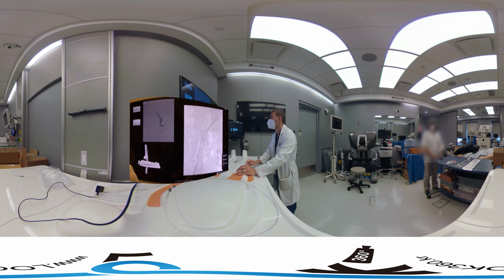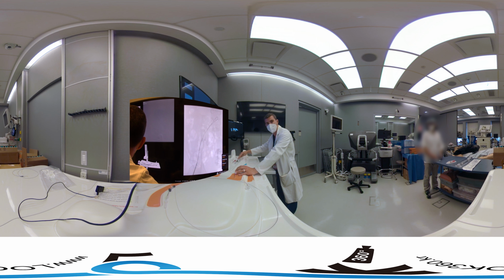That wire is probably selected in the uterine, but what we'll do is we'll come out and we'll do an injection. We'll come out with the wire, and we'll do a quick injection and just see where we are. Yep, so we're in the internal iliac. That gives us a nice injection there and shows us that other part of the uterus that we need to embolize.